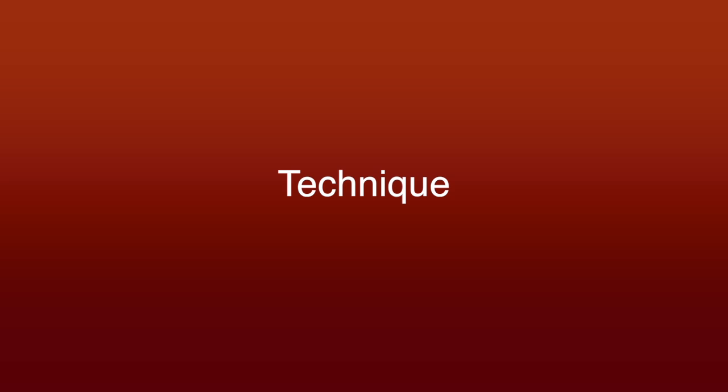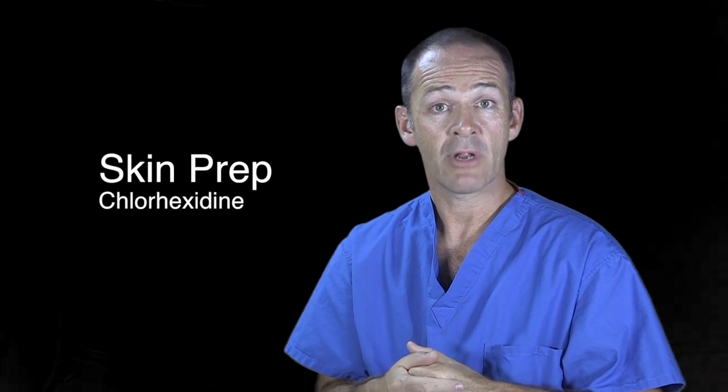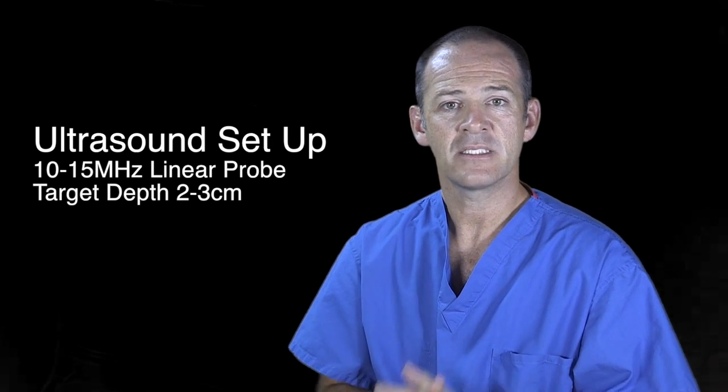For monitors, we use ECG, non-invasive blood pressure cuff, and pulse oximetry as a minimum, and more as required. Skin prep: we use chlorhexidine with alcohol. For the ultrasound, we use a high-frequency linear probe, 10 to 15 megahertz.